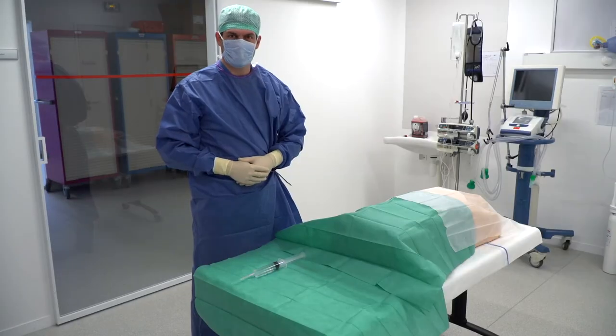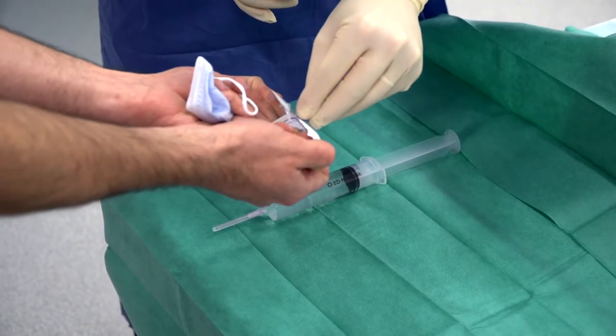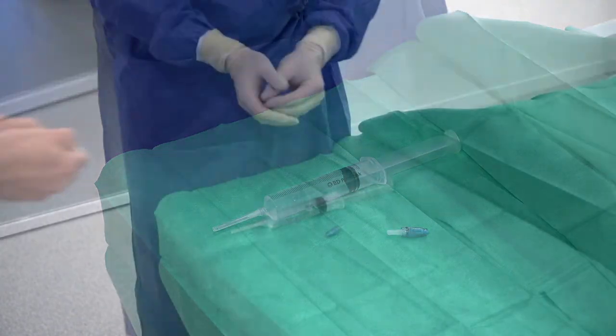We present the installation of the connector that we daily use in our ICU, but this protocol is applicable with any positive displacement valve. We are going to show you a protocol to set up a needle-free connector with positive displacement on a central venous catheter in intensive care unit.